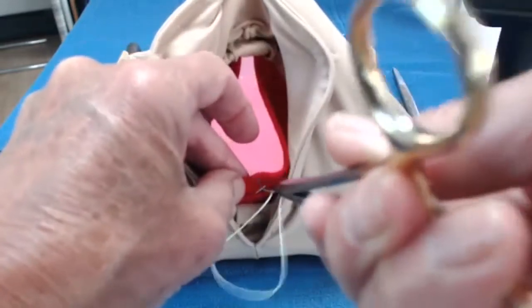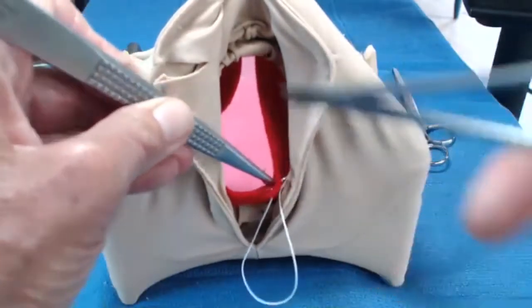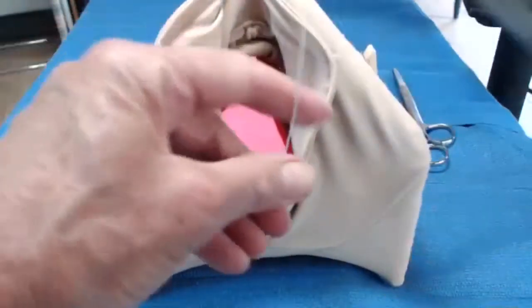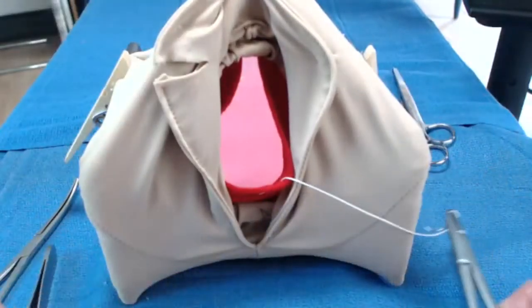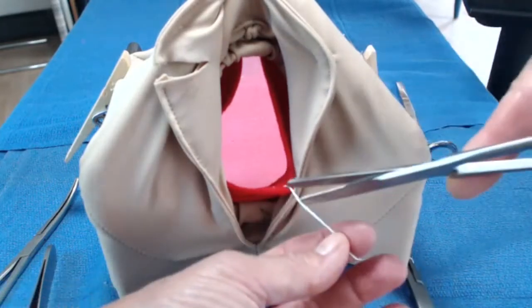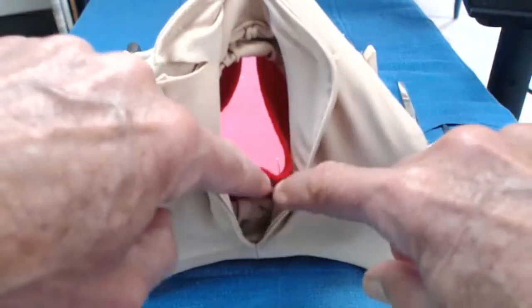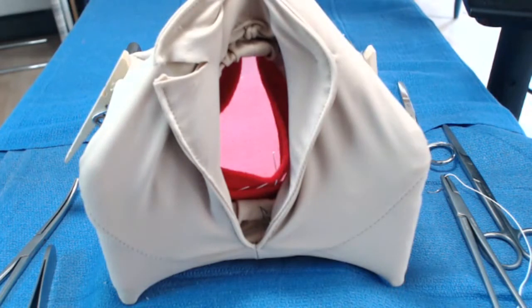When I get done I'm going to bring my needle back up, and then depending on whether there's a vaginal tear, I'll determine what I'm going to do once I have this stitch up and in the vagina. I don't have the vaginal mucosa coming all the way out so I'm going to stop right there. I'm not sure if that provides what the person requesting it needed — I will work on doing a similar model with pieces of meat; I think it will work but I'm not ready to do it just yet. So I hope that was helpful.